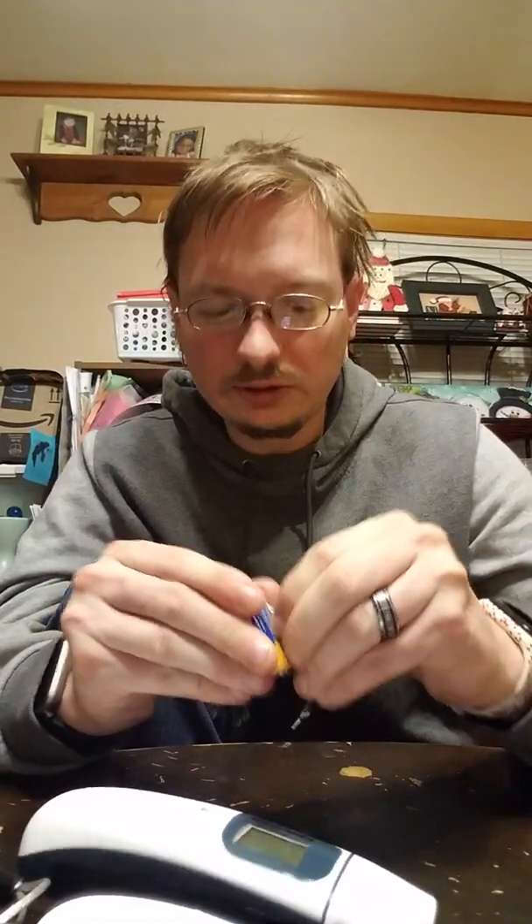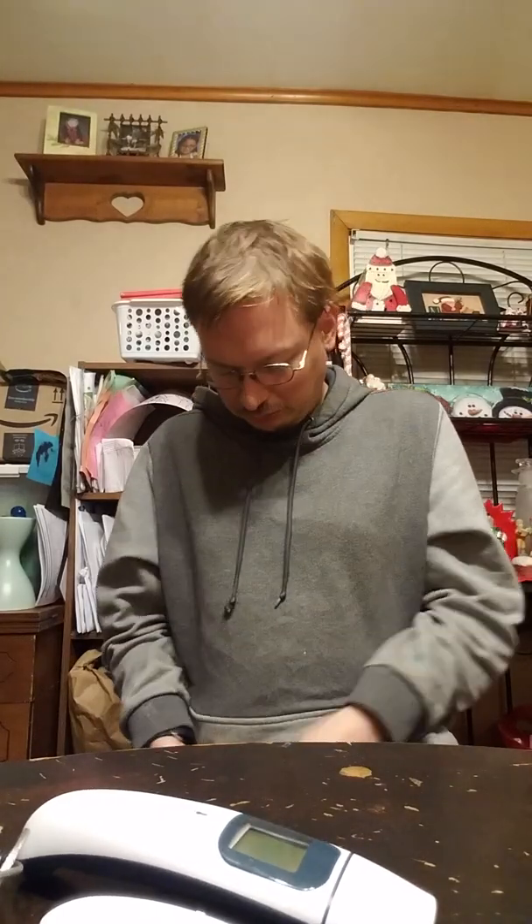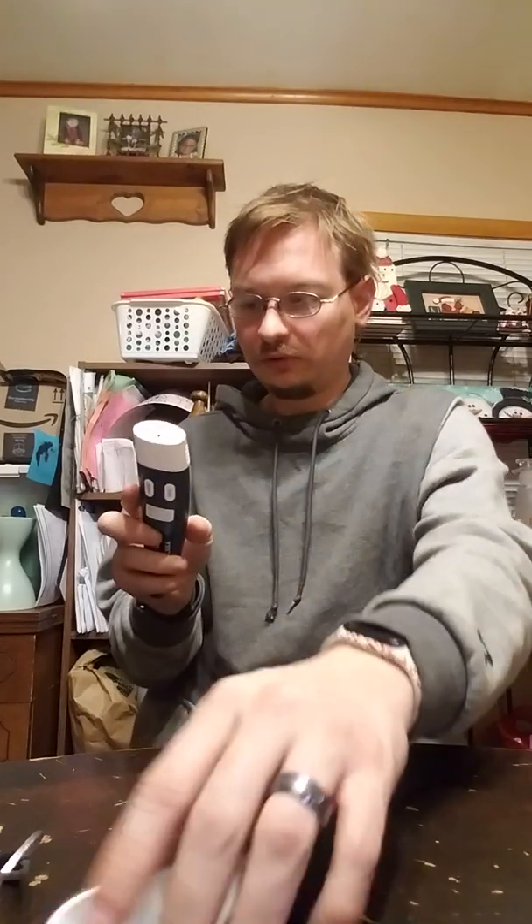Let's crack this open. I just dropped the batteries. Let's get this other battery out and put them in. It's up and running!